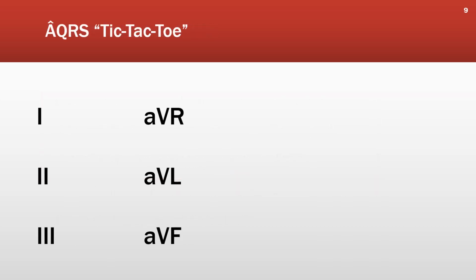Okay, here we have the 6 frontal plane leads arranged just as they're arranged on the ECG printout in most Western countries. It's a little bit different in some of the countries of Northern Europe, but most everywhere else you will see the frontal plane leads listed as 1, 2, 3, then following that AVR, AVL, AVF. So it's as though you're looking at the first portion of the 12-lead ECG right now.